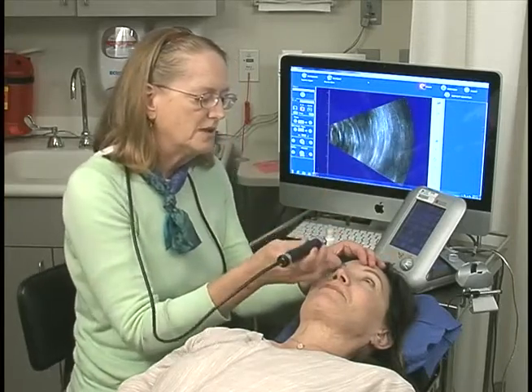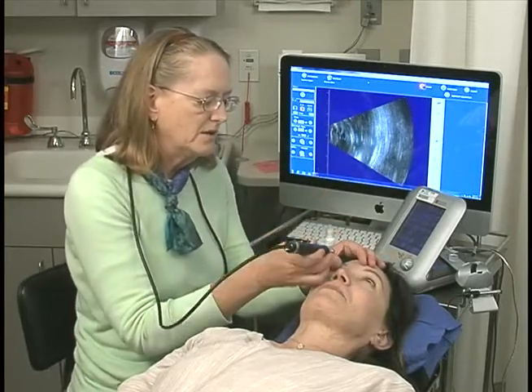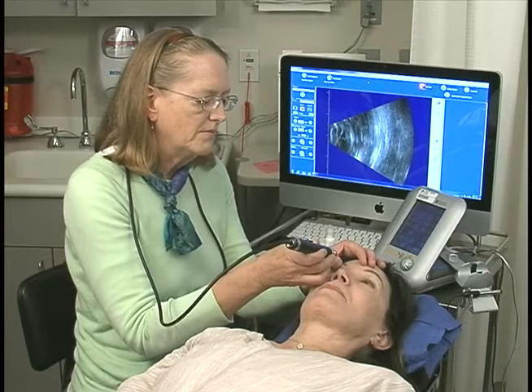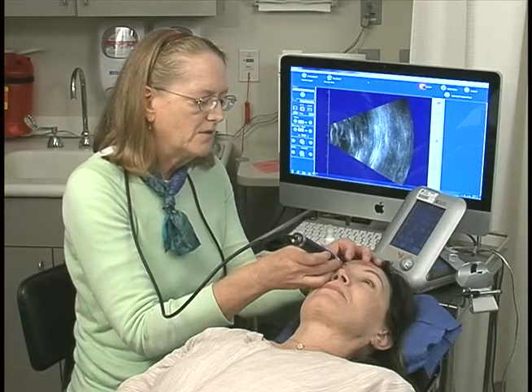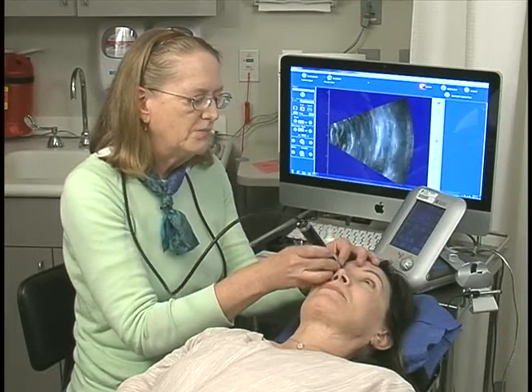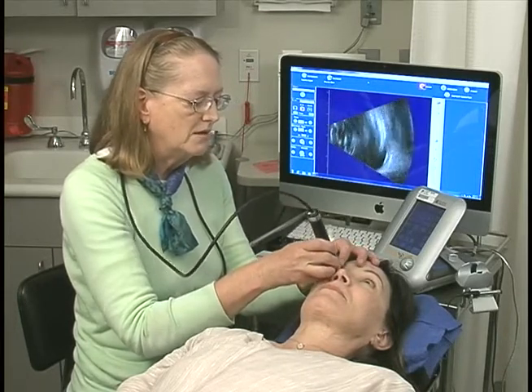Look straight up to the ceiling for me, a little bit lower — there we go. So I put a big blob of gel.